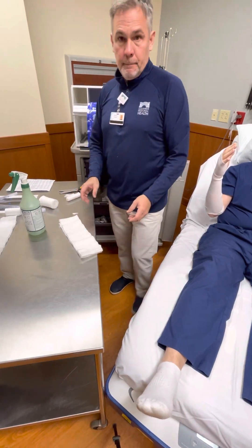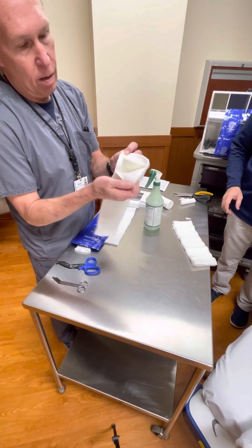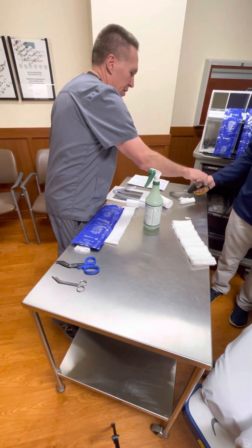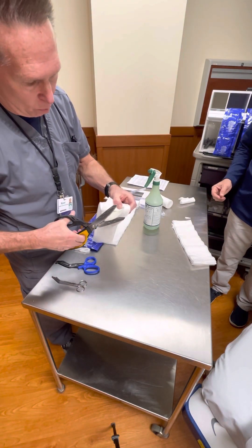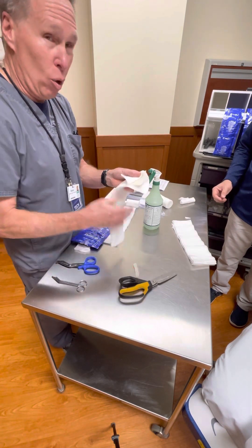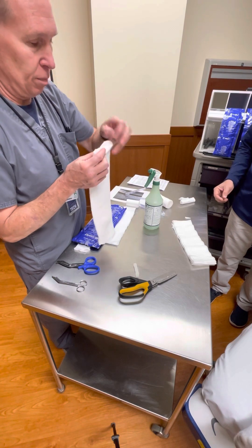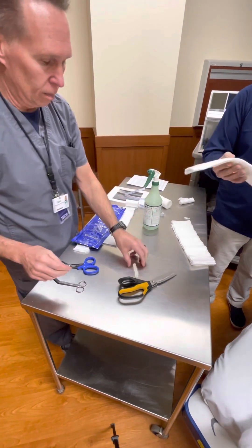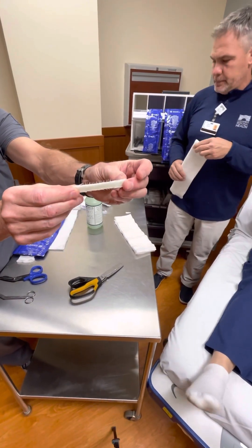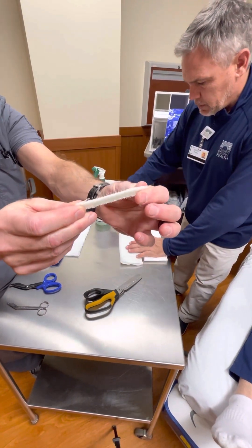If you don't have enough material to pull, these are taped along one side. Take scissors and cut about a quarter of an inch off. If it's not pulling like you want it to, you've solved your problem - and now you've got a little bit of extra padding. It's absolutely key to make sure you're not cutting on that patient. This eliminates those little needle-like protrusions.